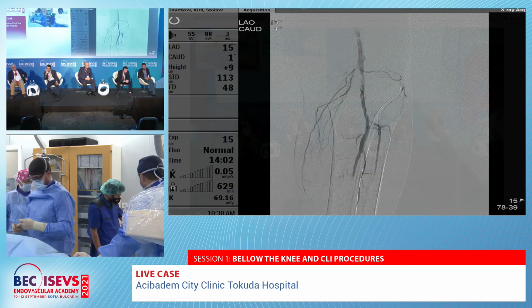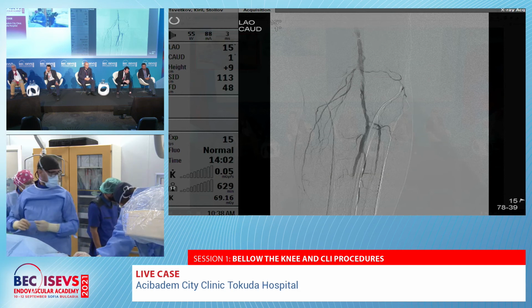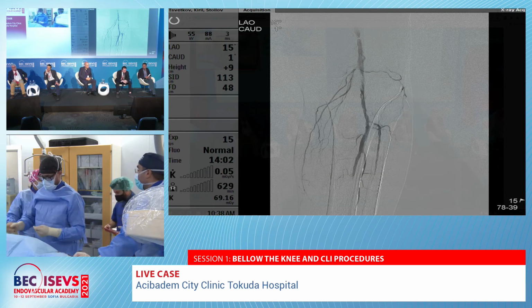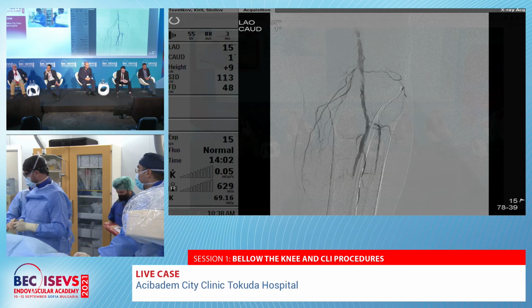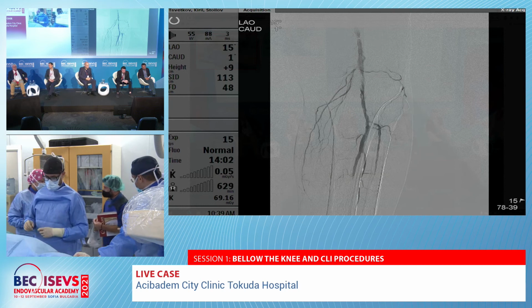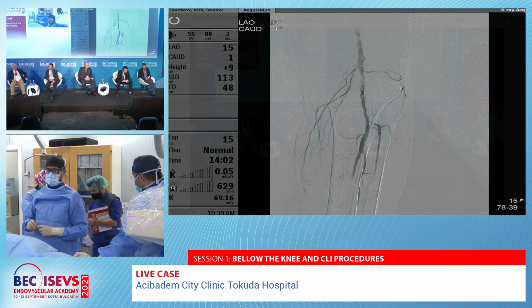A scoring balloon is not a good idea. Give me the 5/120. But you have always the chance to stent it after that. So with the scoring balloon and longer inflation, there is calcium involved at that part, especially it's a very calcified one.